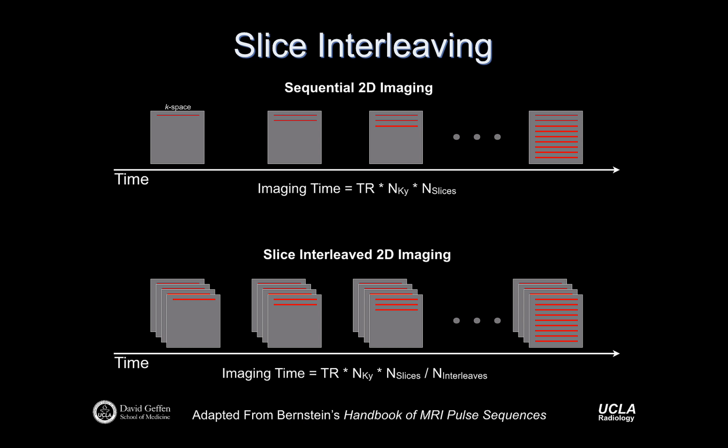Kind of clever. And we still use these kinds of principles, looking at pulse sequences, trying to figure out in what way they're inefficient, and trying to use that time in a smarter way. So I like this as a fast imaging example, simply because it's faster, because it's clever.